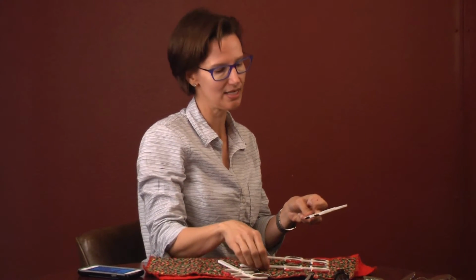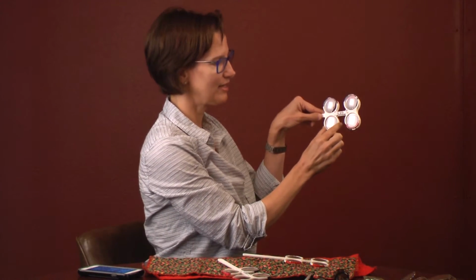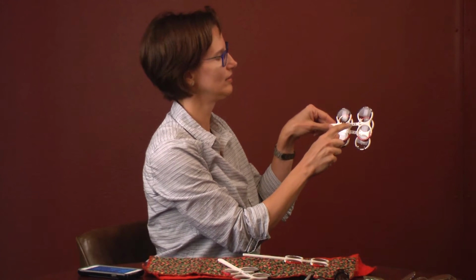If patients say they can't see far away, they could either need a positive lens to help them with the distance, or they could need a negative lens. And you run through it the exact same way as we just did with the positive. So let's say they liked the negative 1.25 side best, which we got by adding the red 4.25 with the positive 3.00. If you can't add and subtract positive negative numbers, do some practice before you come to Honduras.